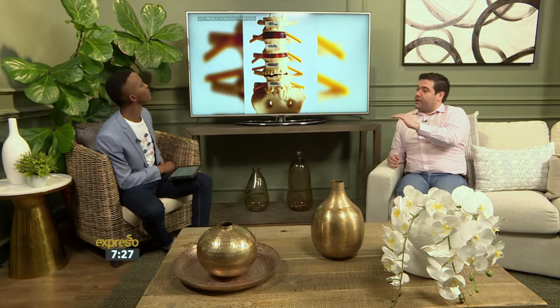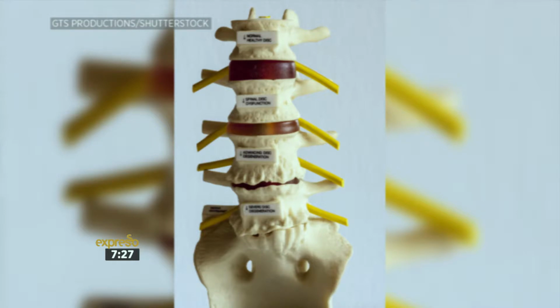Right, so I'm not a doctor, so I can only tell you what I understand. The implants are on the spinal cord from kind of the middle vertebra down, depending on where the paralysis started or which part of your back was broken, or where you're paralyzed from. It's then stimulated through electrodes, so 16 electrodes implanted on the back, on the spinal cord, and then with a remote control, essentially, it's switched on, and there's a very, very strong electrical current going through those electrodes and into the spinal cord, and that's how they realize that they can reverse paralysis.